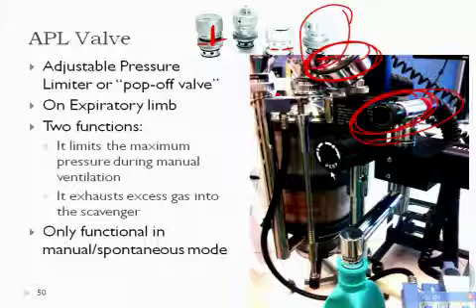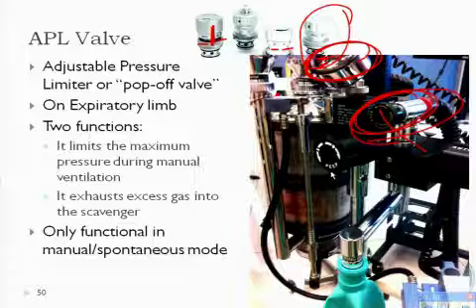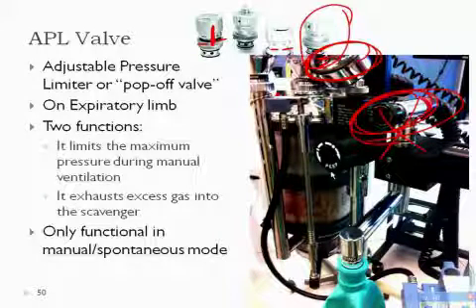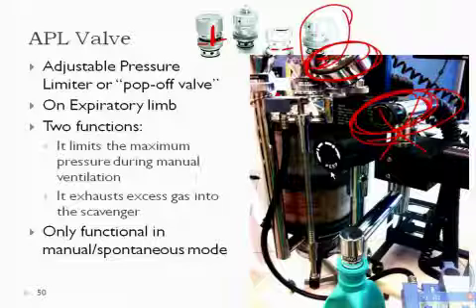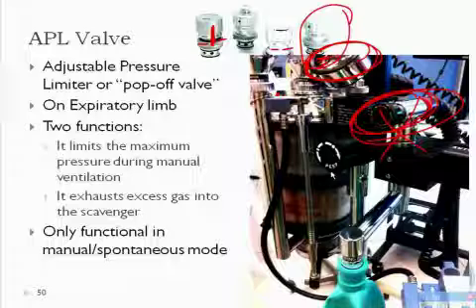But if you have the ventilator turned on, you told the computer to work, it bypasses this. So this is no longer there. Okay. It's no longer there. It's not even a factor. So you could have it all the way closed and it won't matter. It does not prevent anything from occurring at that point.